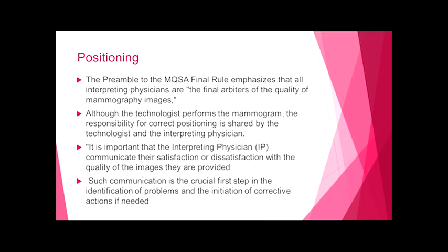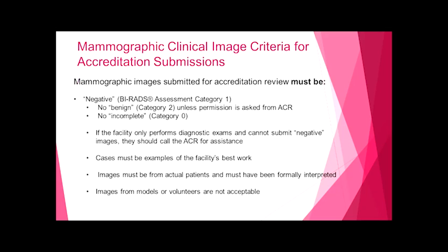We work with a lot of facilities that have had problems with image quality. And many times our role has been not only to work with the technologists in improving their positioning, but also in trying to improve the process and help to engage the radiologist in that process. So the mammographic clinical image criteria for accreditation submissions, this is what you have to have, and Deborah will be discussing this in great detail.